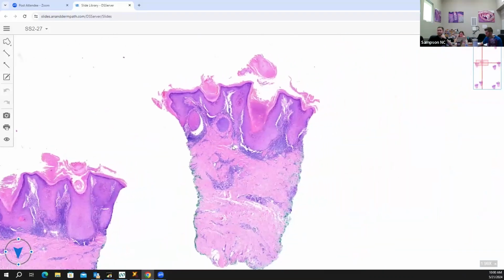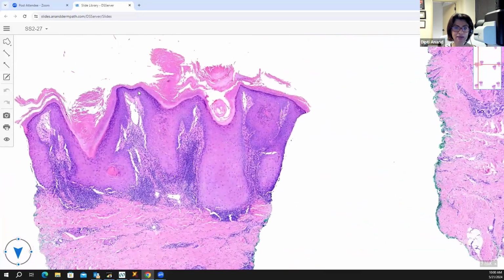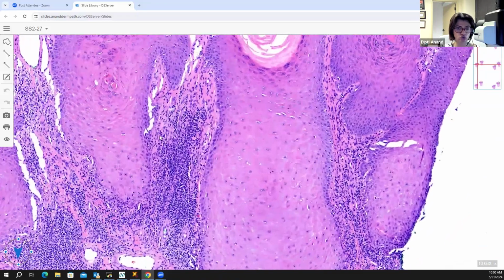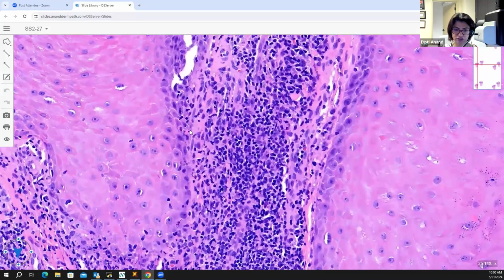I guess it's LP. It's hypertrophic LP. Hypertrophic LP presents with marked epithelial acanthosis, hyperkeratosis, wedge-shaped hypergranulosis, so that attracts your eyes. The bottom, even though it is thick, is actually irregular, jaggedy, sawtooth-like, and the lichenoid inflammation over a period of time dies down. What is left behind as a telltale sign is the jaggedy sawtooth. But here you do have the lichenoid pattern as well, and you can see the cytoid bodies.